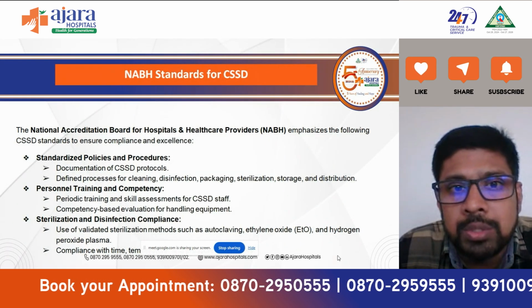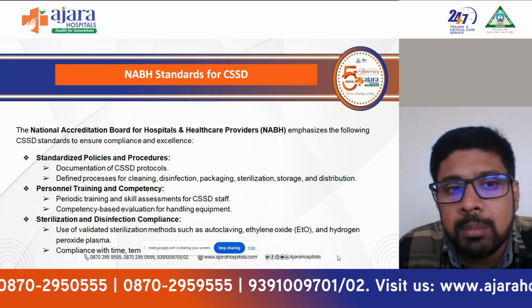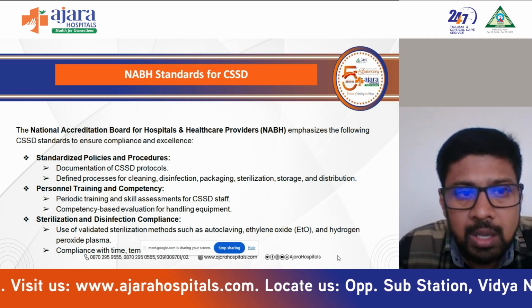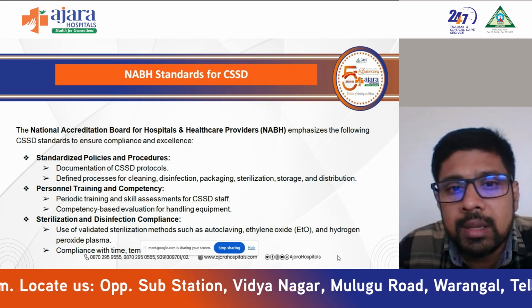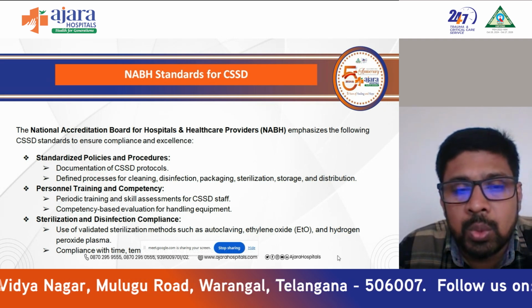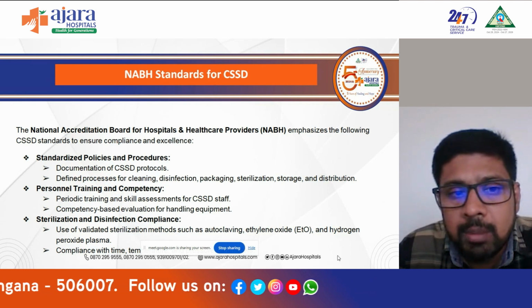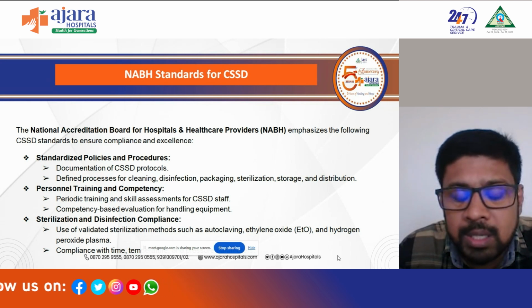Now we'll look into some NABH standards for CSSD. What are the recommended standards for CSSD operations? NABH always ensures quality and excellence. So there are certain standards to follow to maintain this compliance and excellence. We need to have a proper SOP, standard operating procedure. Then documentation in the CSSD is another important thing.